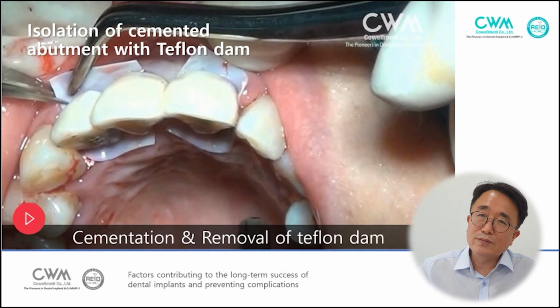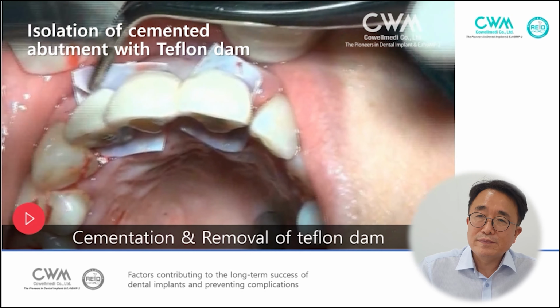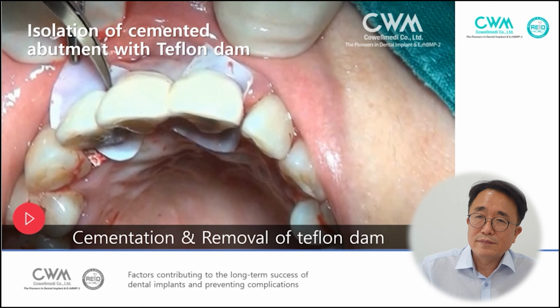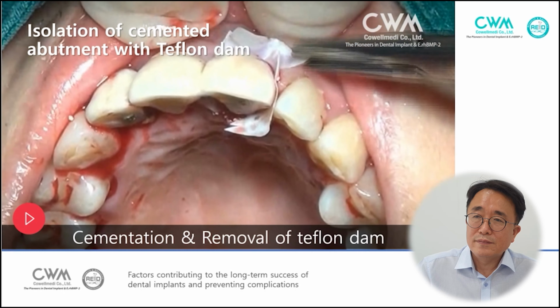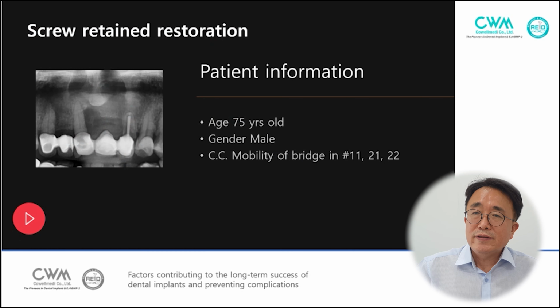And then remove this Teflon. Yes, we can remove cement. And screw-retained restoration for the patient.